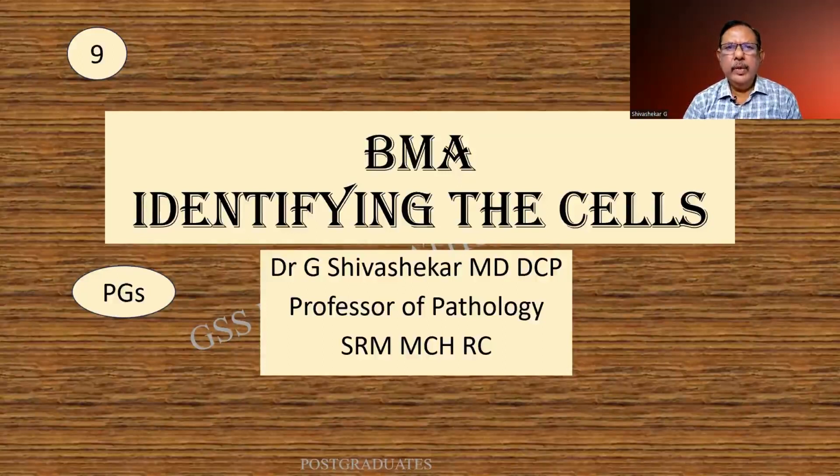We shall be continuing with our classes on bone marrow aspiration. As I had been telling you people, it took me nearly 2 years to identify the cells, thanks to Professor Sethuram. In this class, I shall be continuing with the leukocytic series. We have already covered the myeloblast and the promyelocyte.